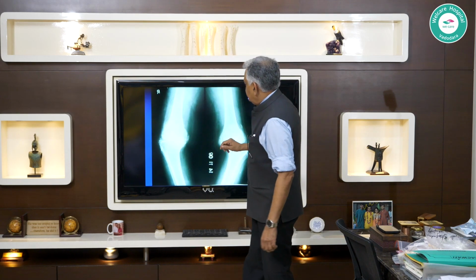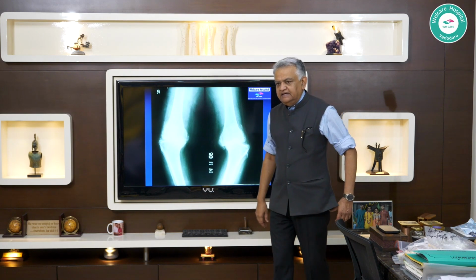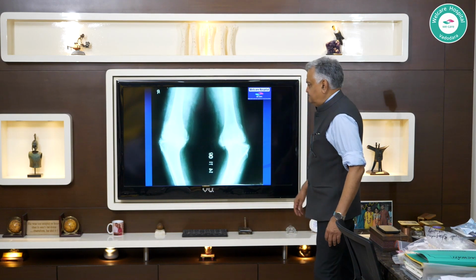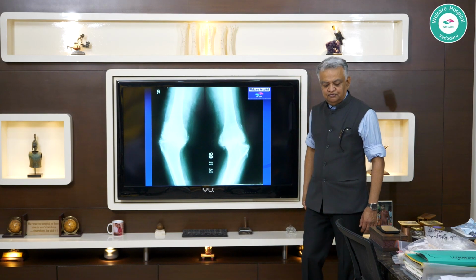Why is a very taut ligament at risk compared to a ligament which is not that taut? Why? Even a slight blade. The slightest of sharp blade, if it hits that ligament fiber, it will cut it. So once you decompress it a little bit, it becomes safer in that sense. So you take this out and that will decompress it. Anything else you will anticipate on this side? Kshitij, do you want to comment?